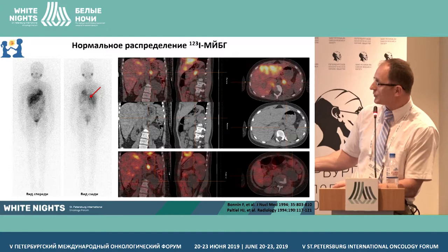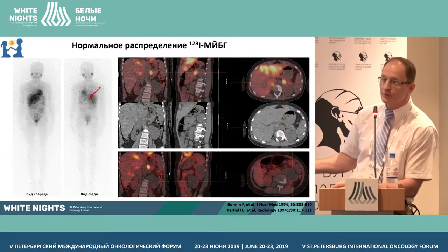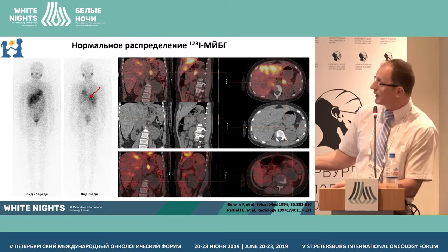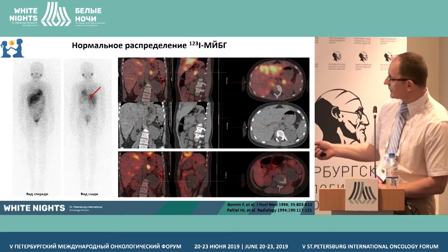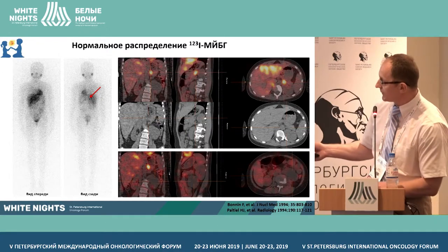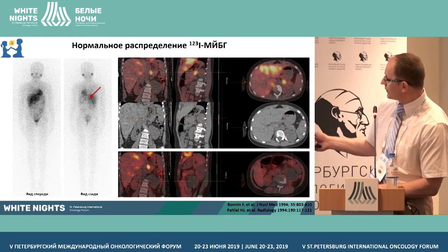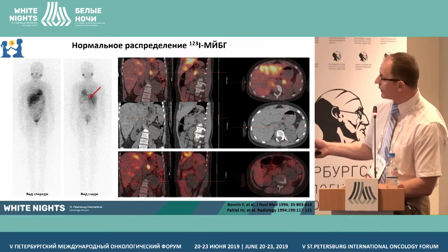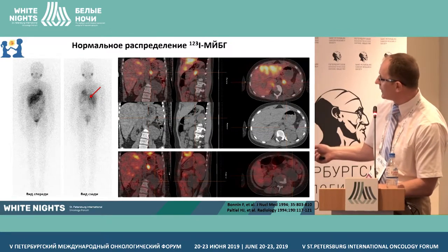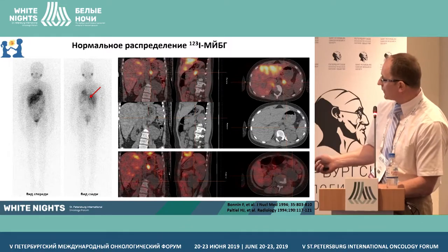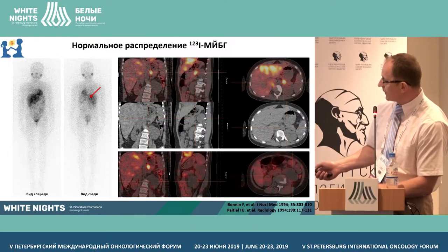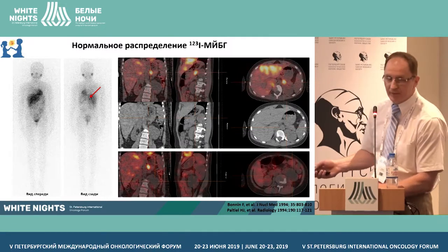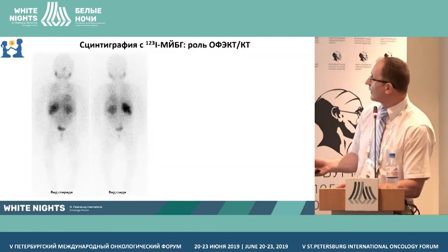These are planar images of the next patient. We know that there is a tumor in the retroperitoneum on the left. We see uptake on the left, but on SPECT/CT we see that the uptake on the left is nothing else but normal physiological uptake in the left adrenal gland, which is unchanged based on CT. The tumor is located lower, at the level of the lower pole of the left kidney, and it is MIBG-negative.